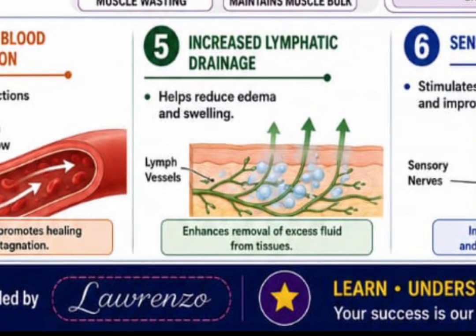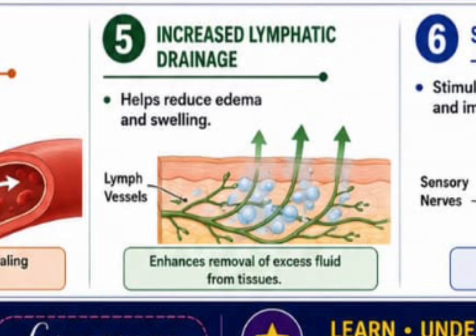Now there's also an increase in lymphatic drainage. Are you getting that? Increase in lymphatic drainage is when blood from arteries enters into what? Muscle tissues, and what happens? They leave back to the veins or to the lymphatic system. So when there's edema, which is pathological accumulation of fluid in the interstitial space, fluid is collected in the tissues, especially in the muscle tissues. So when you increase contractions using a Faradic current, you could create a vibration to the muscle, sending the liquid back into the lymphatic system or into the veins. Are you getting that? So it increases lymphatic drainage and reduces edema.